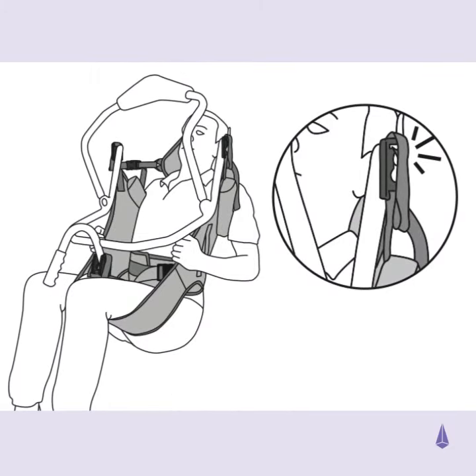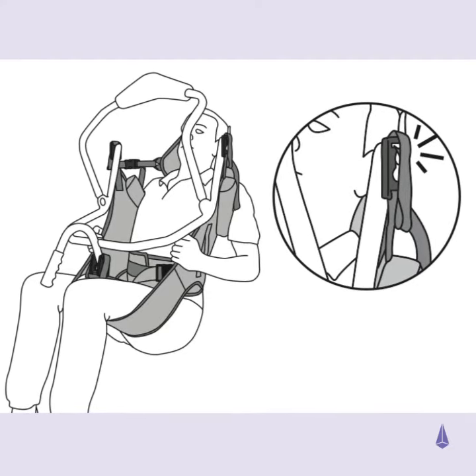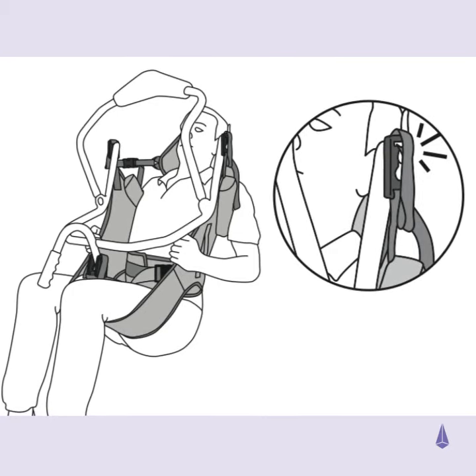Prior to the start of the transfer, check that all tapes are not twisted, the clips are fully engaged and firmly clicked onto the hoist studs.